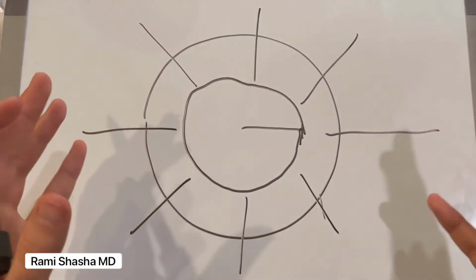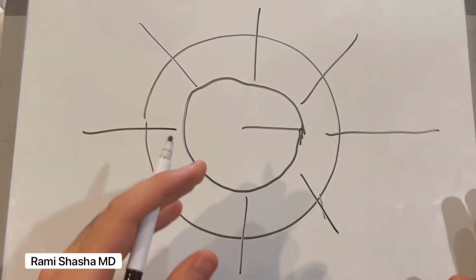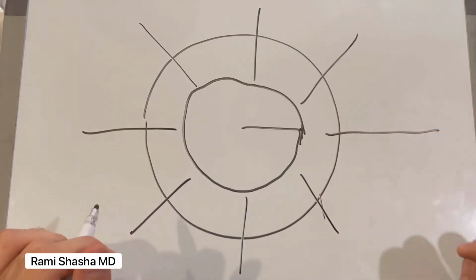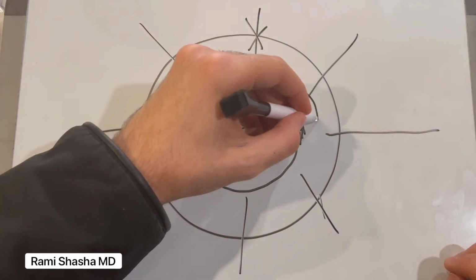Now this topic can get complicated. What if we're dealing with a multifocal lens and we want a well-centered rhexis? This can be challenging. So it's really important to recognize this. Otherwise, like I said, you're going to strip zonules. There's a high risk of extension.